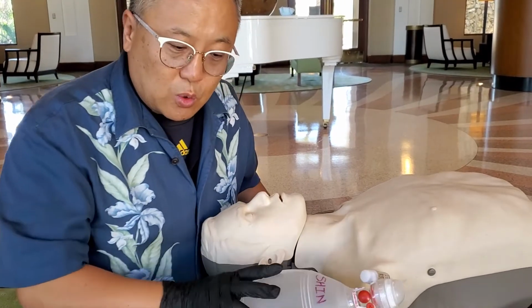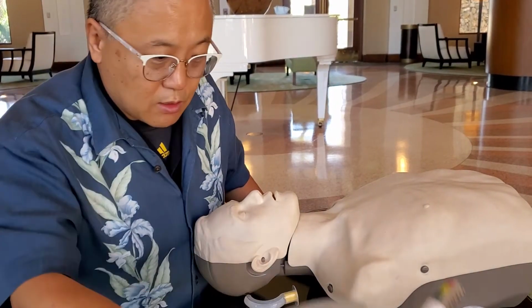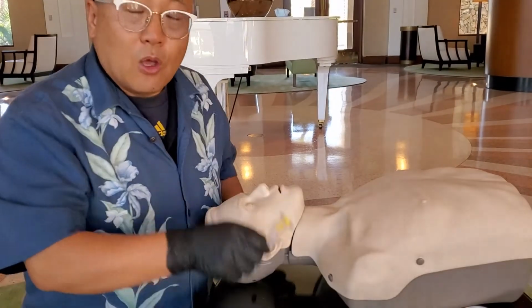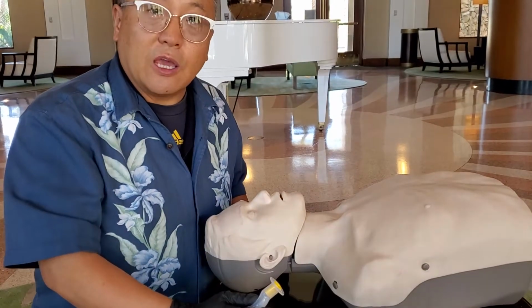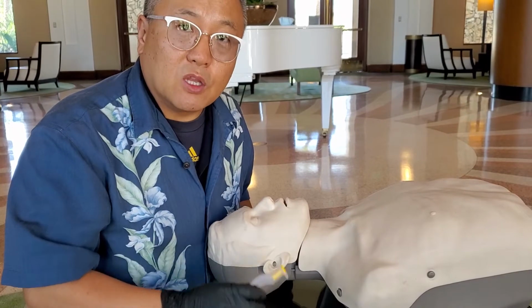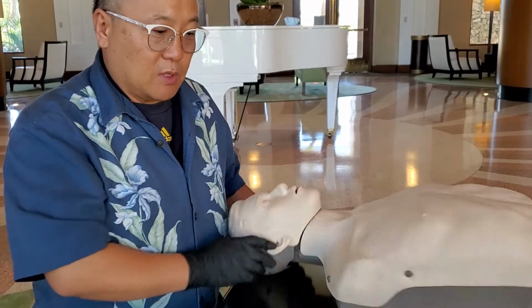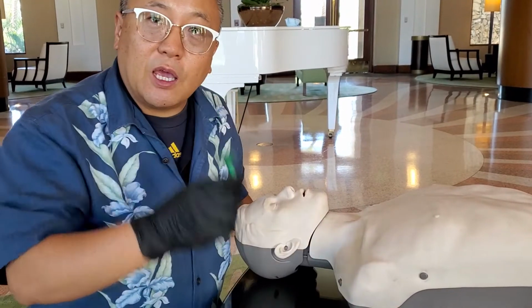So one more time. When you use the OPA, it is a contraindication when the patient is conscious. We do not use the OPA on a conscious patient. The patient has to be unconscious. Okay. Move on to the NPA.